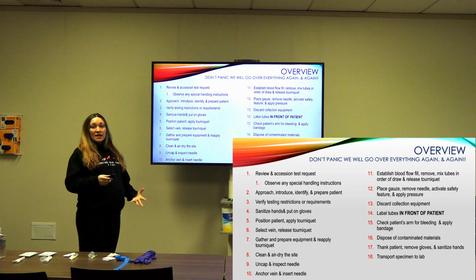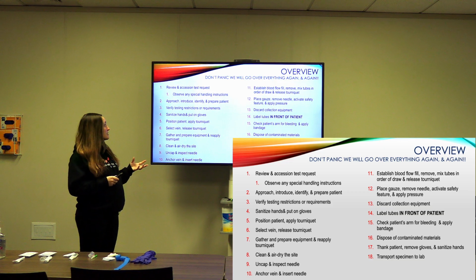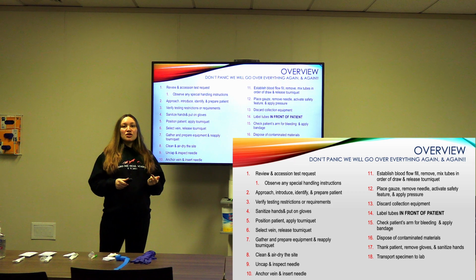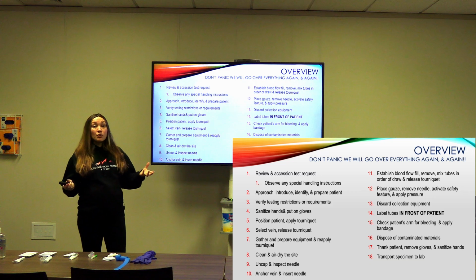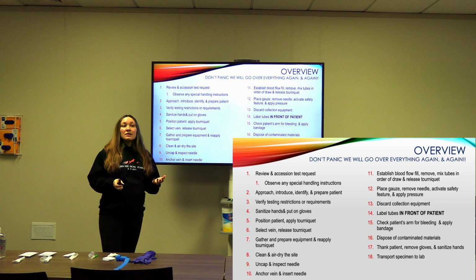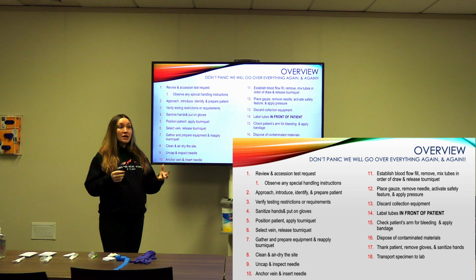Once you know what test you're taking and what special instructions you have for each test, you can then approach, introduce yourself, identify and prepare the patient, and that just looks like hello or good morning. My name is Samantha. I'm here from the lab. I need to take a blood sample. Is that okay? Get consent, and answer any questions that they might have regarding the tests.